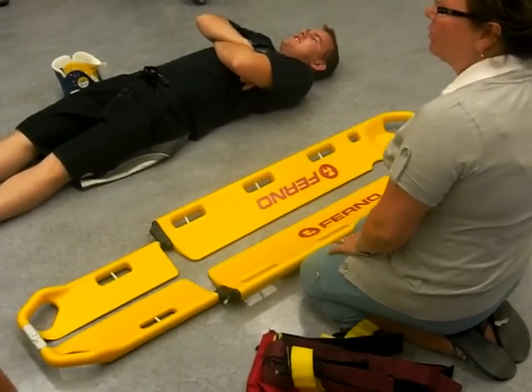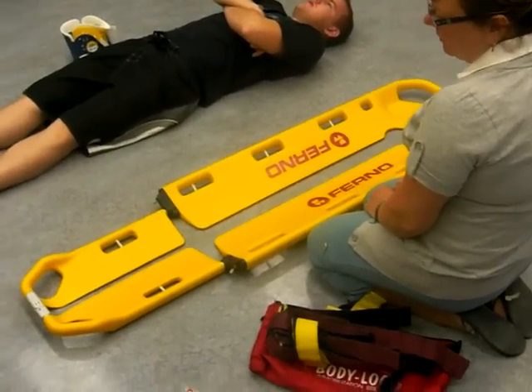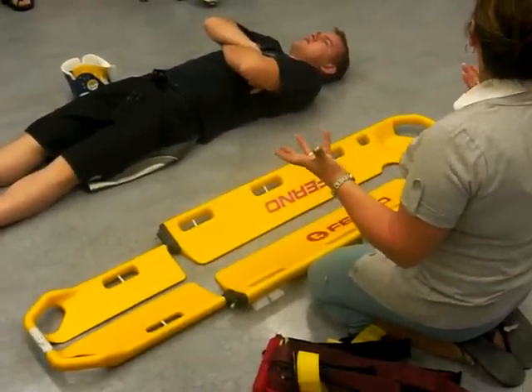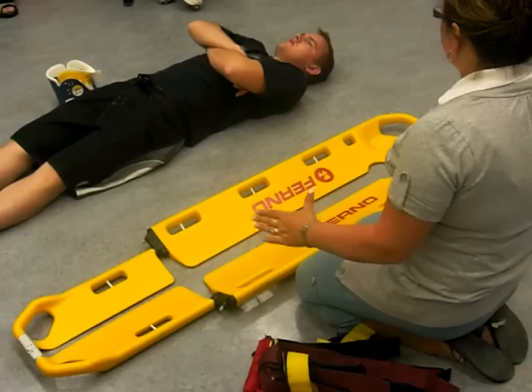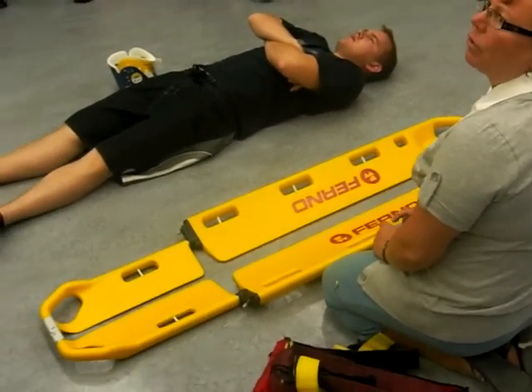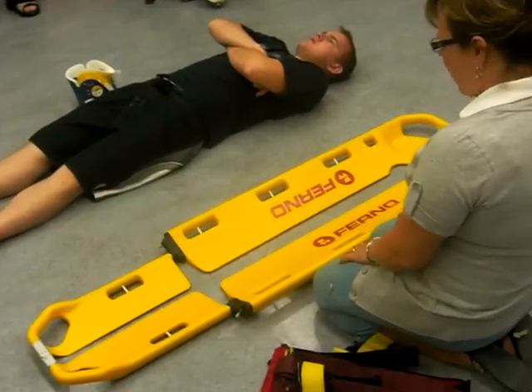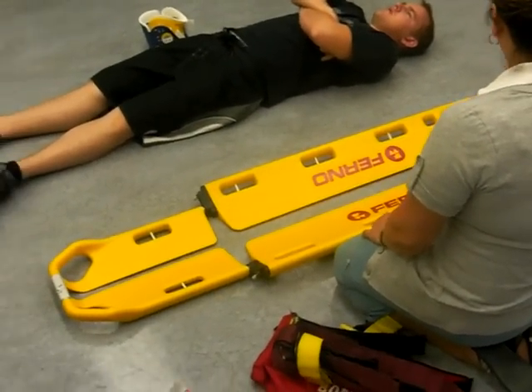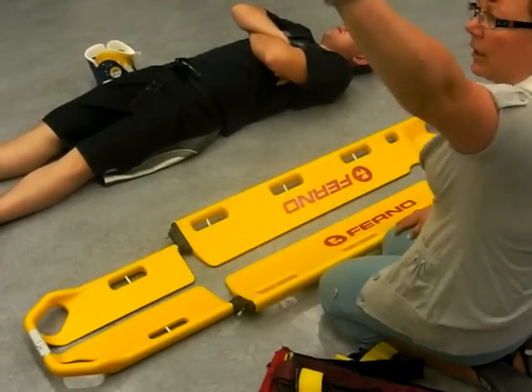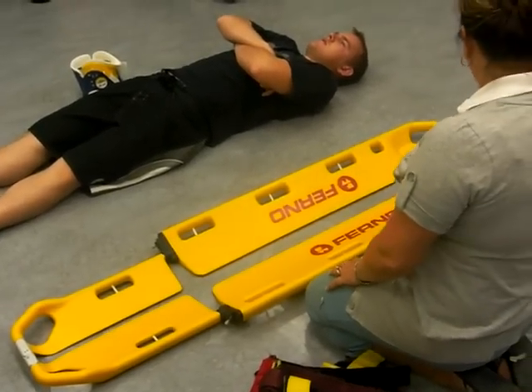The old ones are aluminum — you've probably seen those shiny ones. Those are the older ones. When you take them out of your ambulance, it's very warm. When you put them on snow, snow sticks to it, and then they become very cold for your patient. Aluminum transfers heat and cold, so that patient stays relatively cold for a long time. Snow generally does not stick on these newer ones. However, if you're in a ditch on an incline, they're like a toboggan — be very careful because they're going to go zing, there goes your patient.